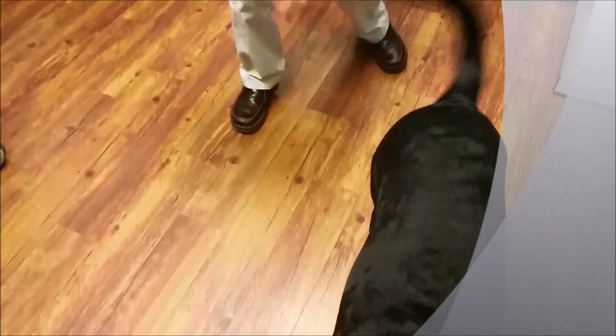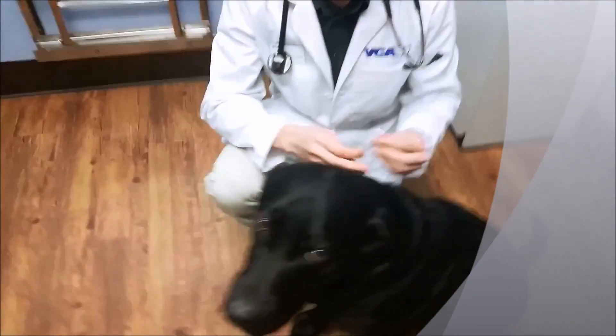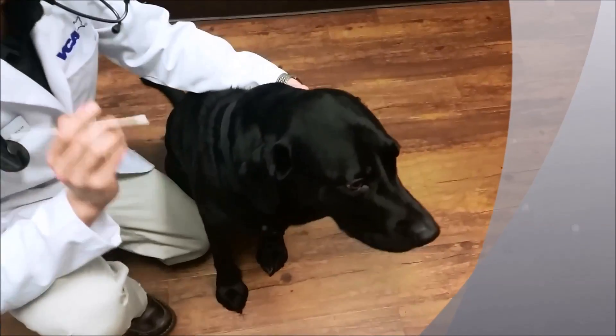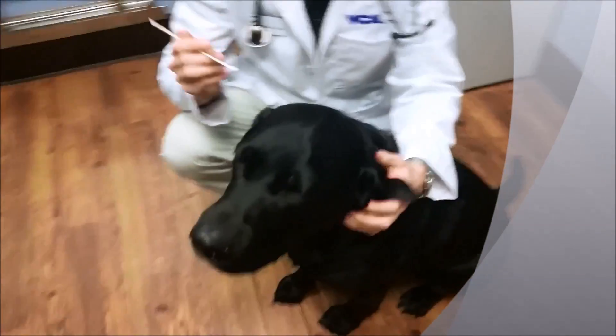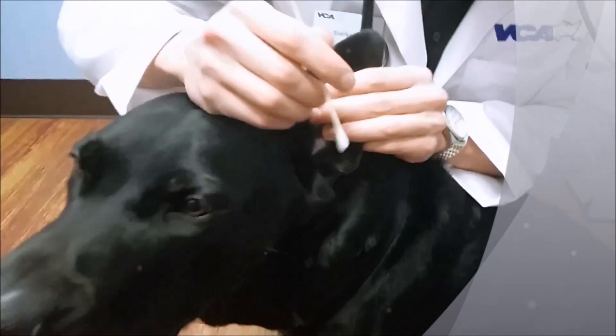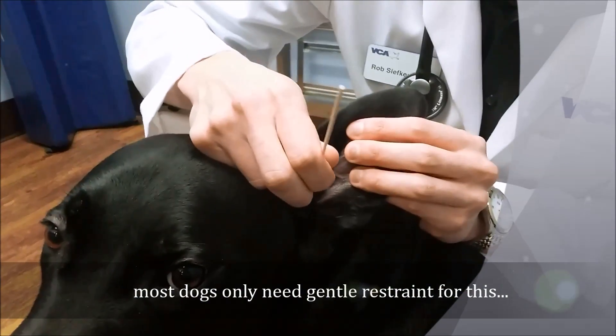I'll grab some Q-tips. I'm going to stay out of your way here and have Camille follow the action. So we're going to the left ear, and I'm going to go ahead and lift the pinna of the ear here. I don't want you guys doing this at home with Q-tips or anything like that, but I'm going to try to reach in.